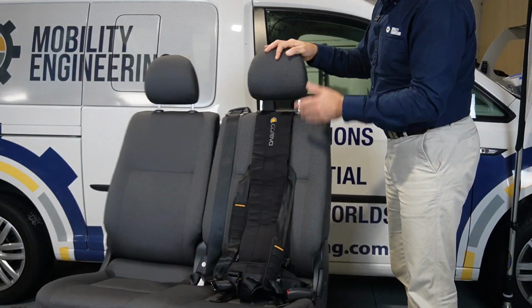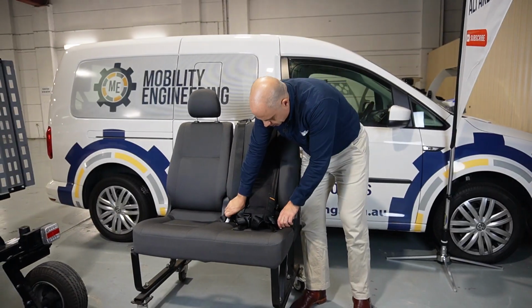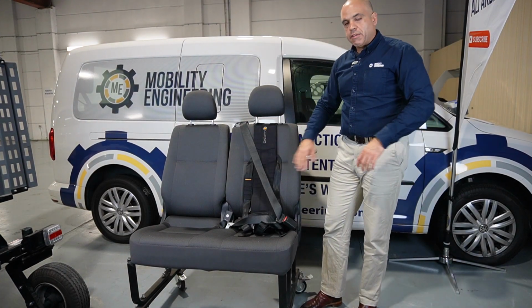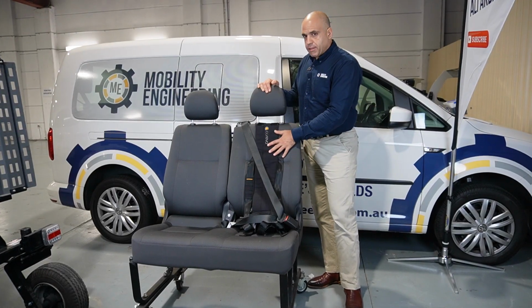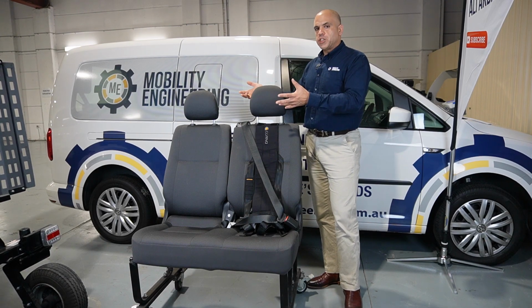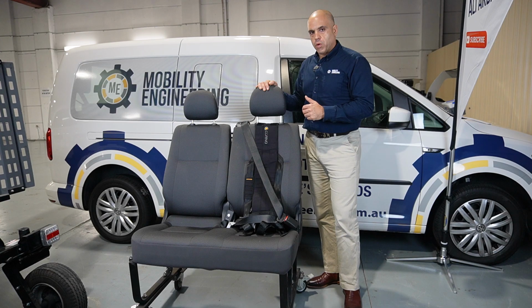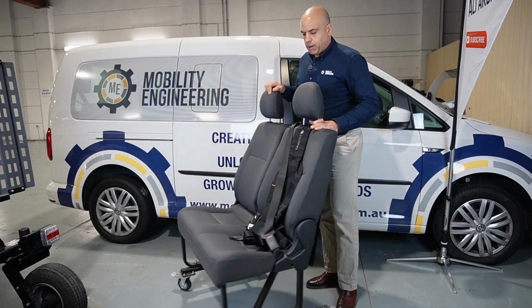Then what happens is you put your harness on, and you still put your seatbelt on over the top of the harness, right? The seatbelt is still the thing that is securing you from a safety point of view. These harnesses are not a safety securement device. They are functioning for their purpose, in this case posture support, in the other case behavioural support. So the question is, can I fit it in a sedan type vehicle?